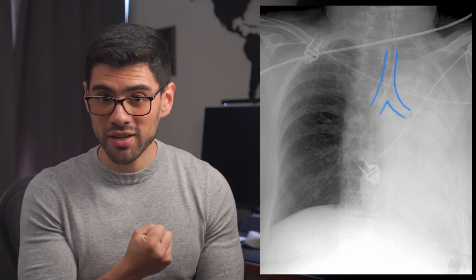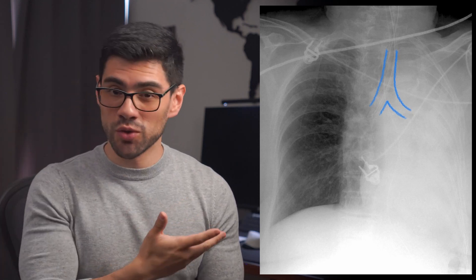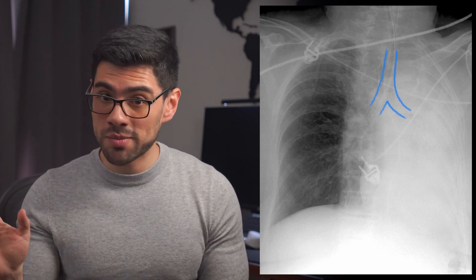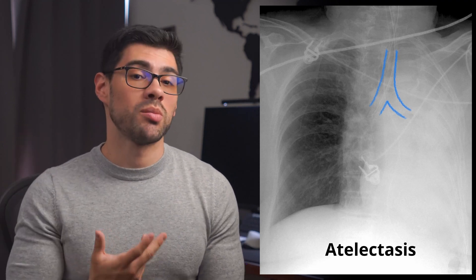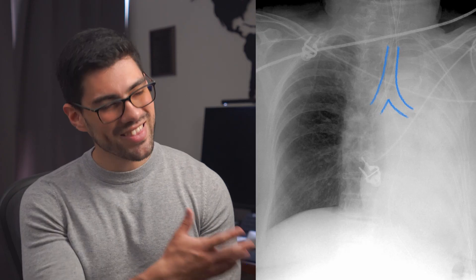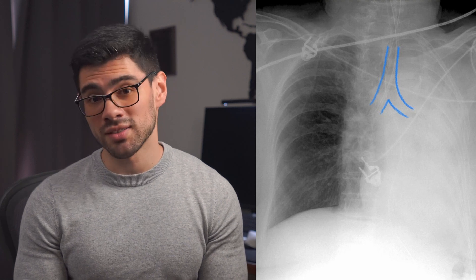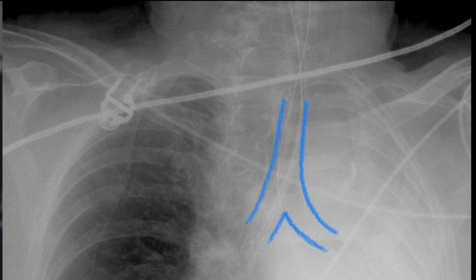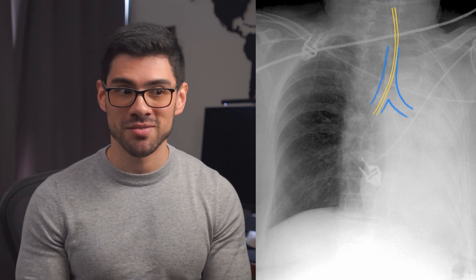In the second image, the tracheobronchial tree is being pulled towards the white lung, so we're thinking collapsed or absent alveoli. The first step is to determine which one: atelectasis is the most common diagnosis, but occasionally patients have had a lung removed — for instance, for cancer treatment. In this case, however, the diagnosis is clearly atelectasis. You can see an endotracheal tube lodged right into the right main bronchus. If you intubate a patient but only deliver oxygen to one lung, the other one collapses — and that is exactly what happened here.